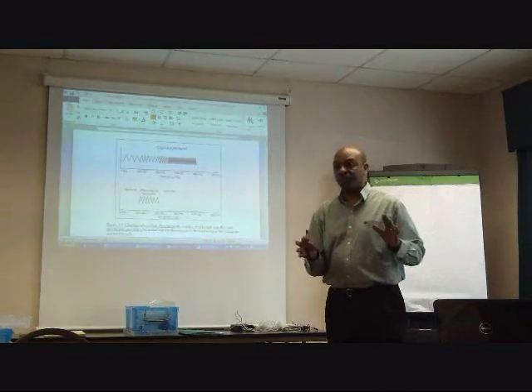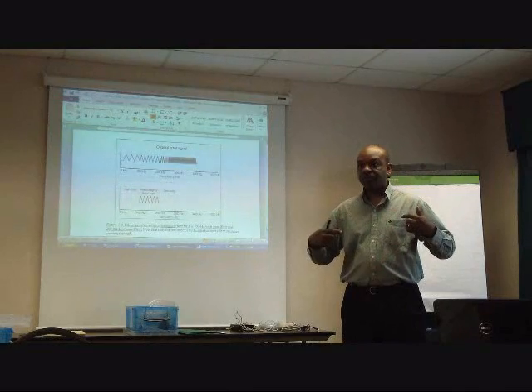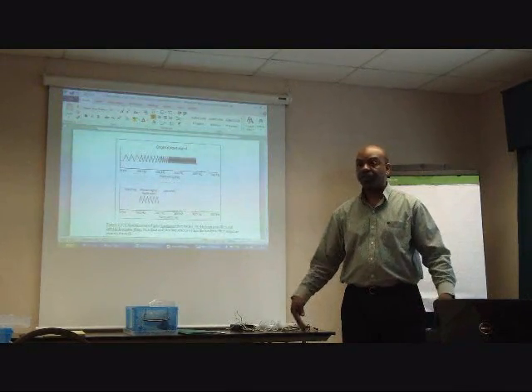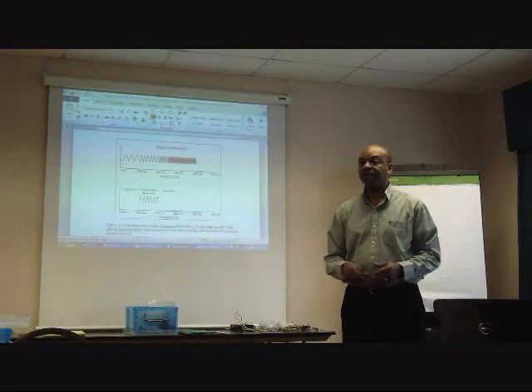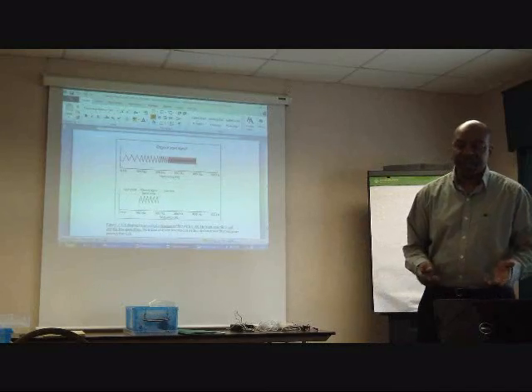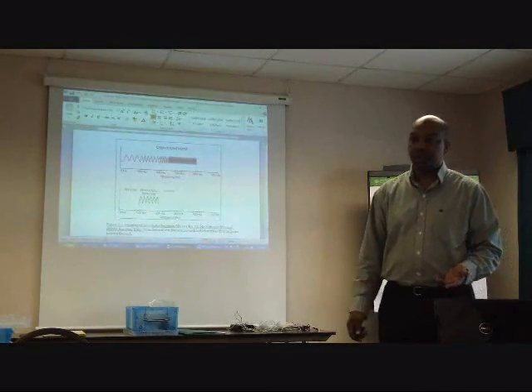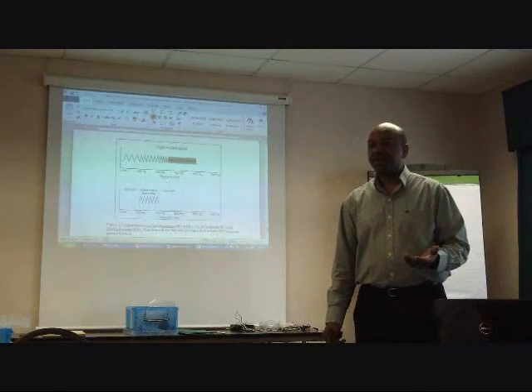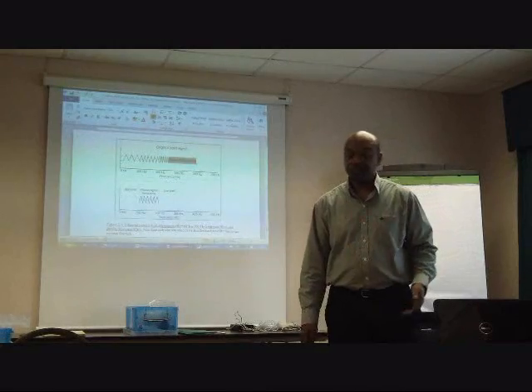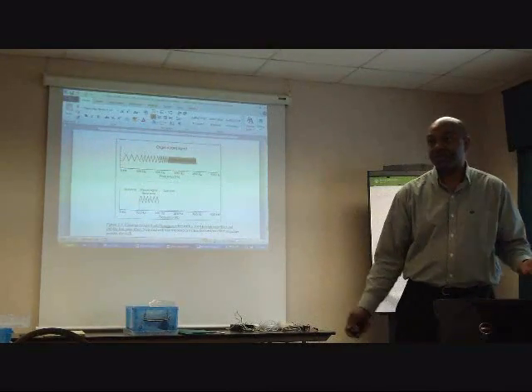And so a sort of general rule is, if you're working on the torso, then use a narrow filter. Okay. If you're working on extremities, further away from the heart, then you can use a wide filter. Got it. And it's a trade-off, because when you go to the wide filter, you are more open to artifact, but you're also getting more of the signal that is there. So it's a trade-off, and you just have to decide what's best for the situation.